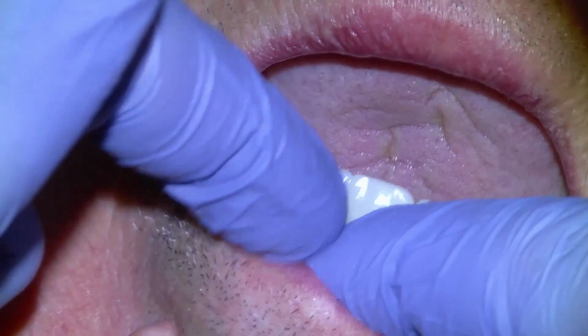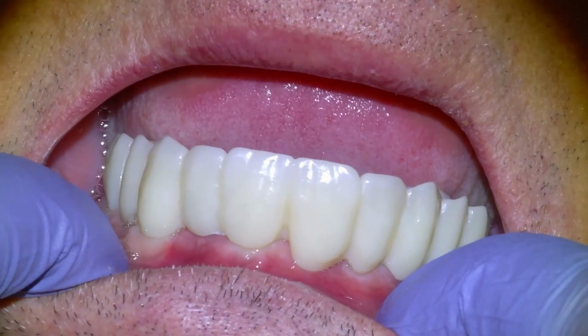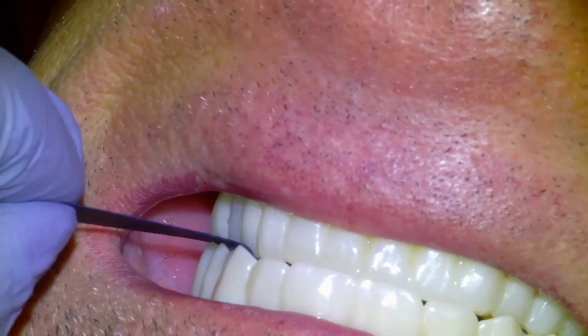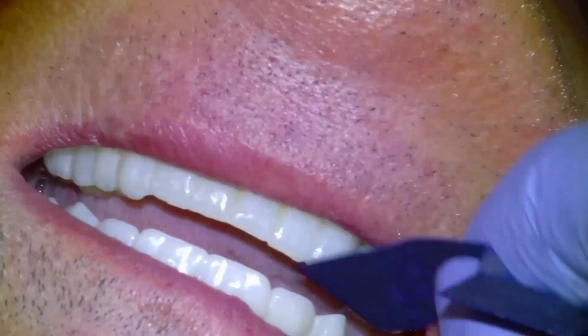yeah, we were happy with the look. You can see that the gum tissue is kind of blanched a little bit white, and that's because it does put pressure on the gums. It's going to feel tight for a day or two until it accommodates. We're going to check the bite with this articulating paper, and we were very happy with the bite.